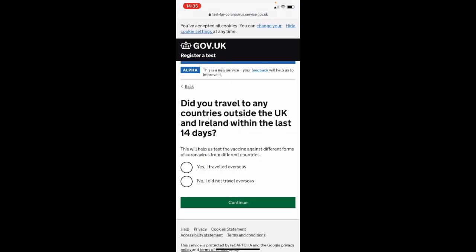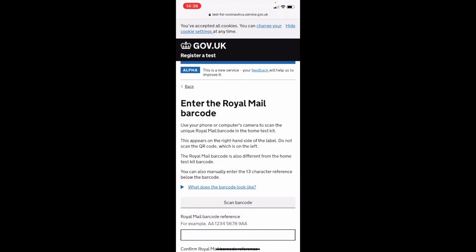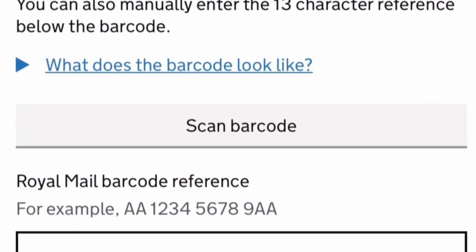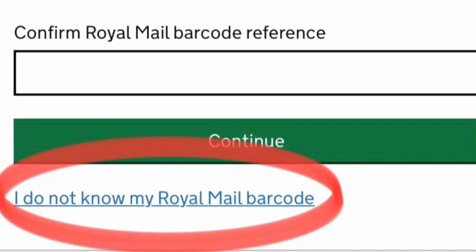You'll then be asked if you've traveled anywhere and where you're taking your test. You'll then be asked to enter the Royal Mail barcode. You don't have one of these on your kit, so please scroll down and press 'I do not know my Royal Mail barcode'.